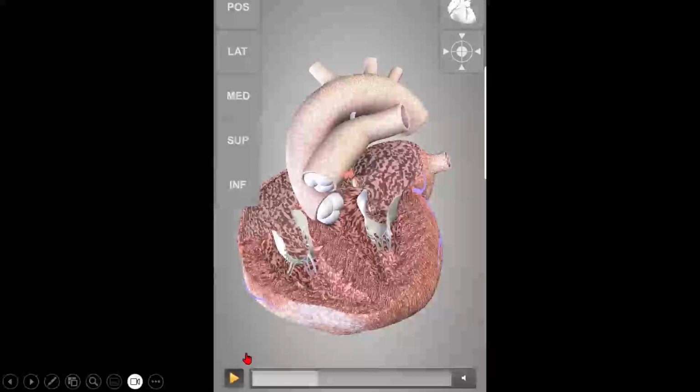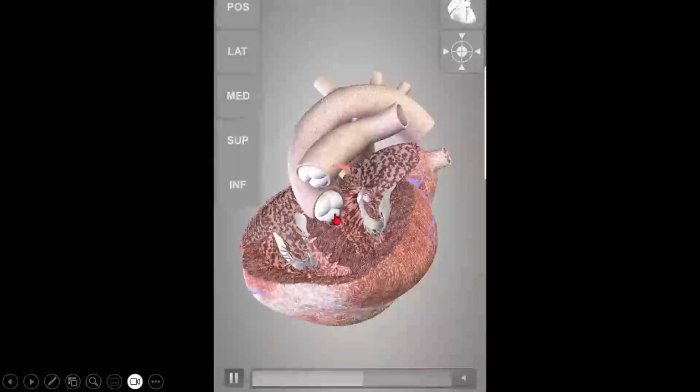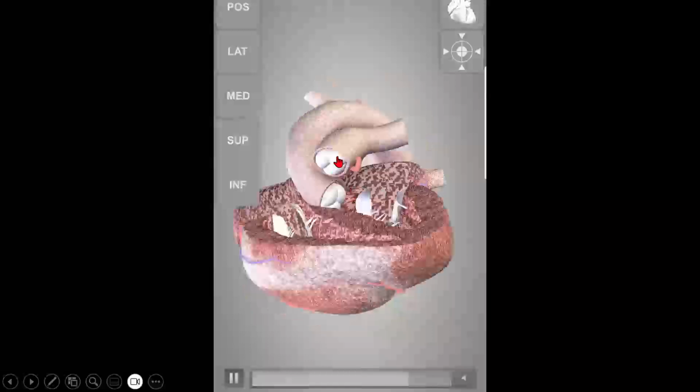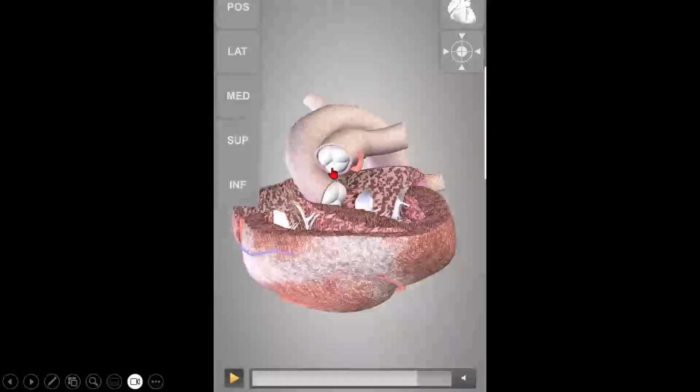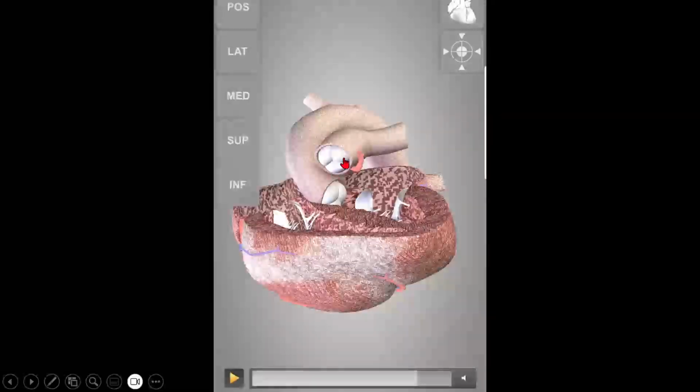Okay. And when I sweep the probe more anterior to that, what happens? Anterior to the aorta is your pulmonary artery. You can see this pulmonary artery and aorta are in different planes. The pulmonary artery is anterior to the aorta and at right angle. So when I start seeing this pulmonary artery in the structure, the aorta is gone. Okay, so the pulmonary artery is at right angle and anterior to the aorta, and then you start seeing the pulmonary artery. So this is your more anterior sweep.